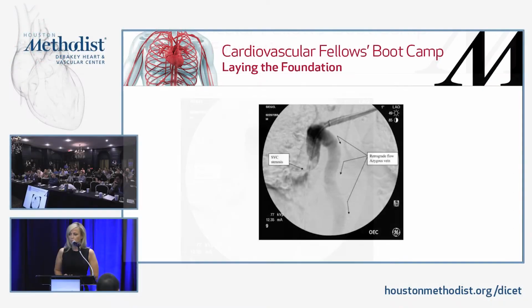So who can tell me what this large vein that is in arrows? This is a large collateral. This is the azygos, correct. So the azygos vein becomes one of the largest and most important collaterals, particularly for the right side of the thoracoabdominal region and the chest. So the right side is usually collateralized by the azygos vein, although it participates in the drainage of all of the venous drainage of the body.